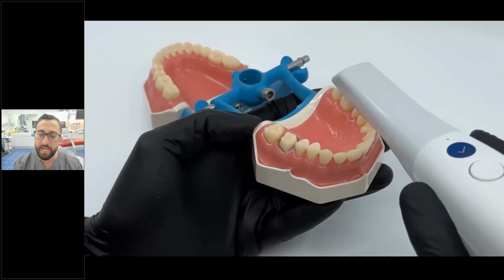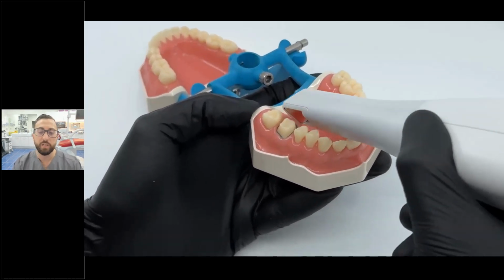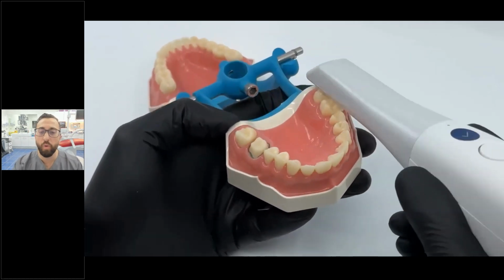This is a full arch scan in a nutshell. So you started on the occlusal aspect, you rotate buccally or lingually, which one you choose doesn't really matter, and then you go all the way around.